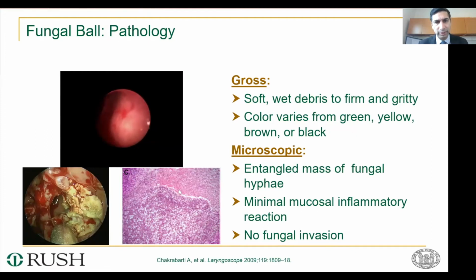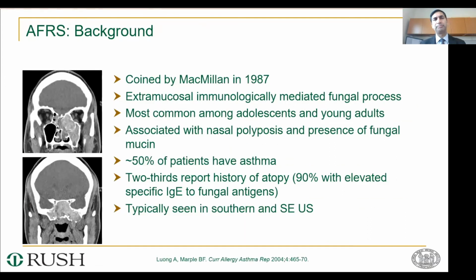And when you look at this microscopically, you'll see this entangled mass of fungal hyphae. You'll typically see a minimal mucosal inflammatory reaction, which tends to be neutrophilic when present, and there's no concern for tissue invasion with just a fungal ball. Surgery with evacuation of fungal debris is curative in these cases.